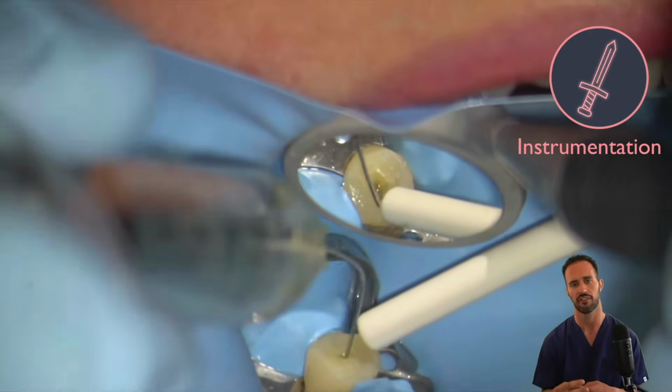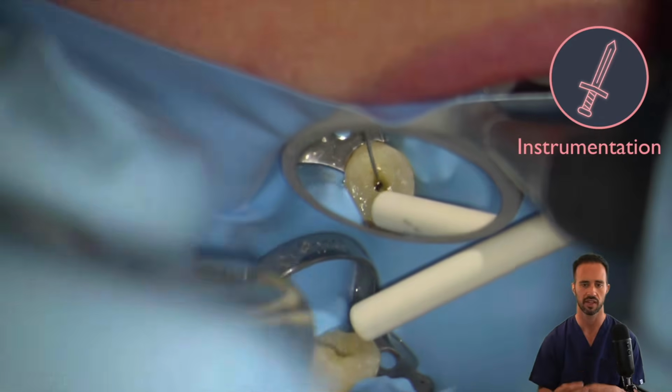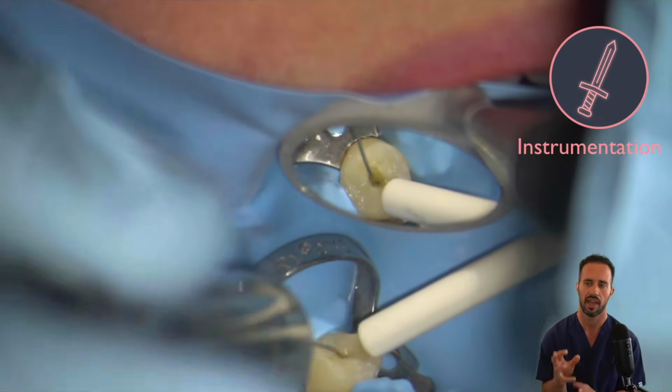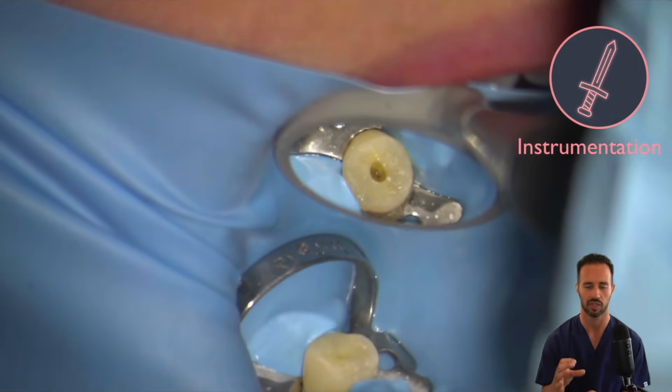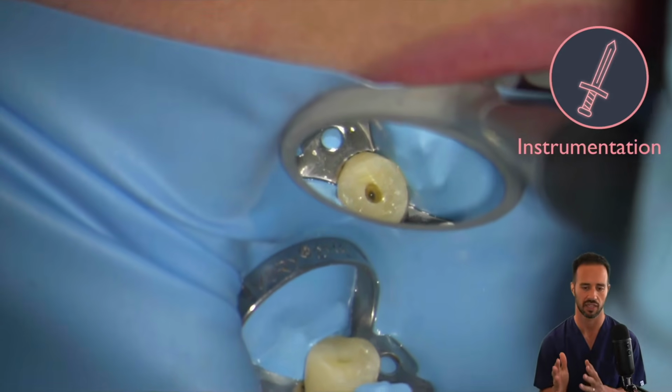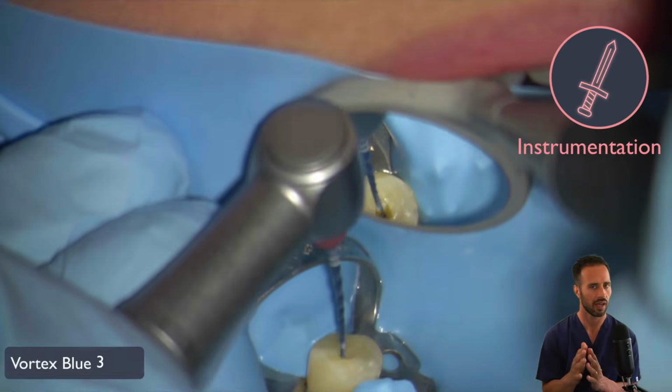And you will start to feel, as you're working these files, when the apical region of the file is engaging with the apex just by tactile sensation, and that's going to tell you that you've thoroughly cleaned. But we got a little ways to go here.